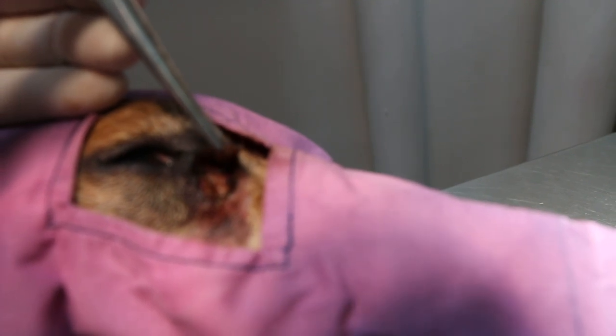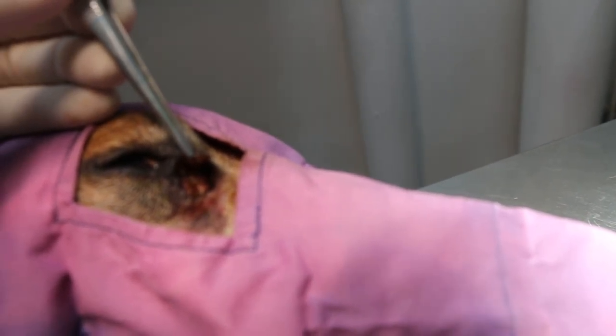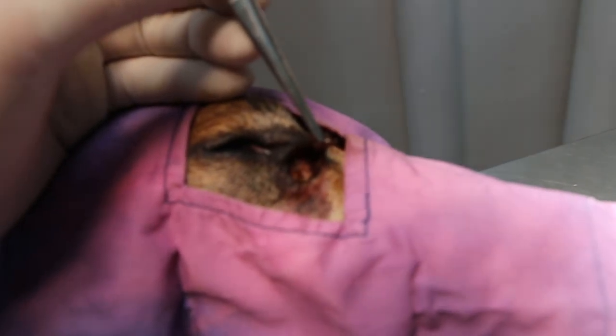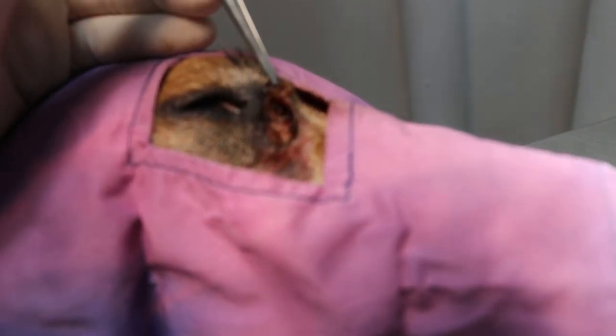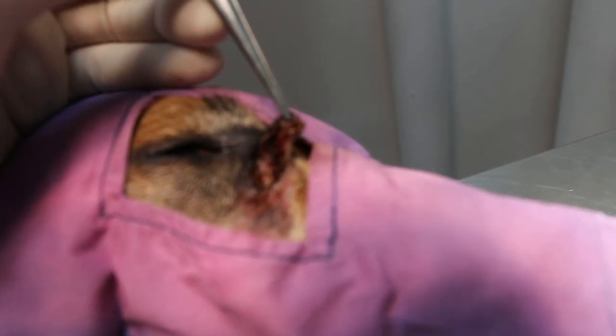It seems to be a cyst from the upper part here, which ruptured — you can see the yellowish-brown fluid leaking out. This cyst is the one causing the swelling. That's how we aspirated similar color fluid. We treat the lacrimal cyst.